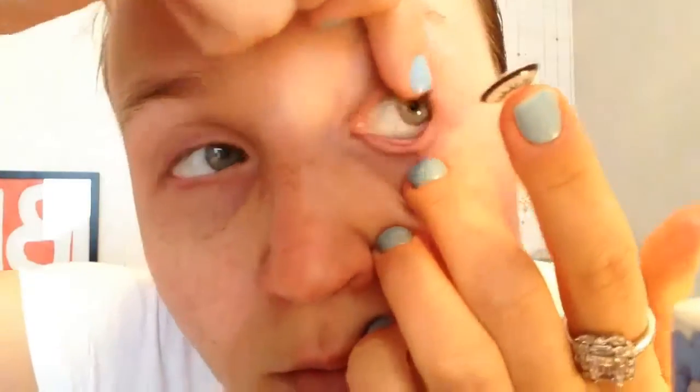With my middle finger I'm going to open the bottom lid, then on my other hand using my finger I'm going to open the top. I haven't really opened the top lid enough so the contact can't go in. I'm opening up the top lid more and put it in, just leave it there for a second.